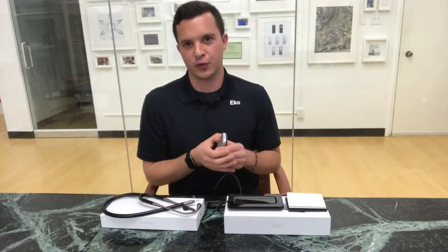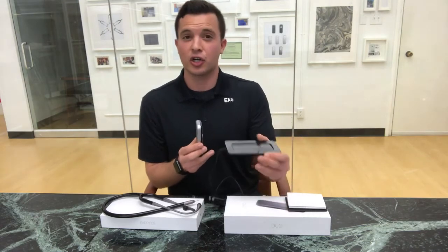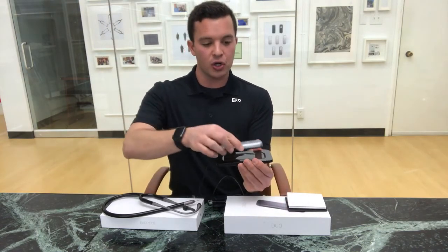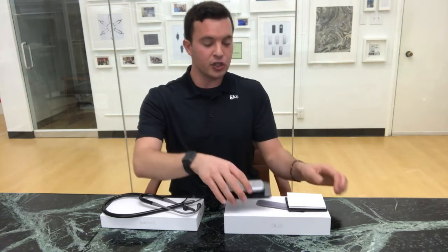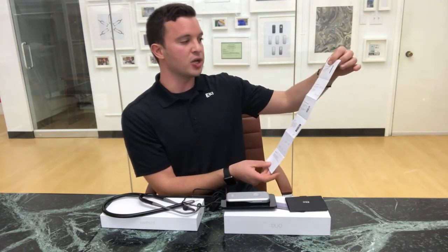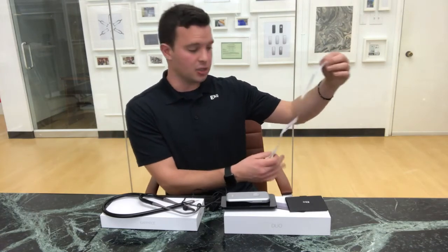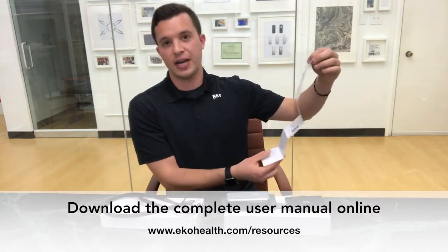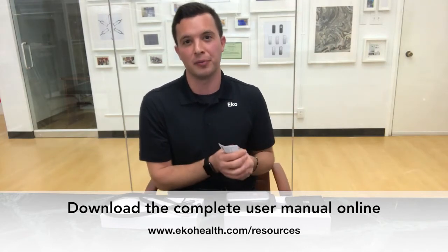The DUO comes with a few accessories to help you get the most out of your new device. It includes an induction charging cradle which allows you to charge the DUO by simply placing it on top of the cradle. It also includes a quick start guide which will walk you through some of the key steps in setting up and getting started with your product, along with information on our LED light indicators, preset stethoscope filters, and where to download our more in-depth user manual and compatible mobile app.